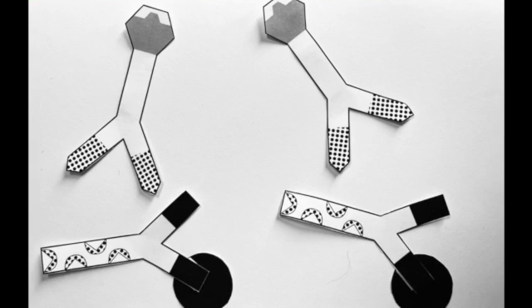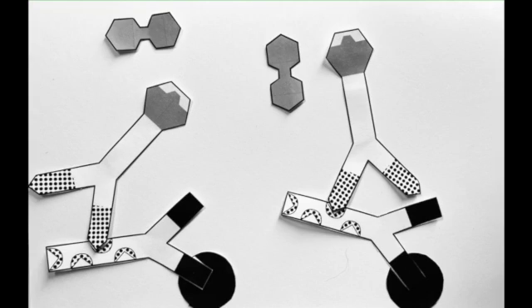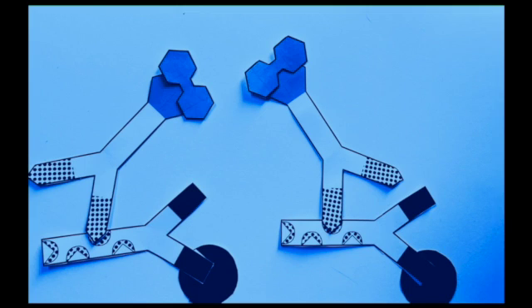An enzyme-linked secondary antibody is added next. In this step, the secondary antibody that has a bound enzyme now attaches to the constant region of the primary antibody. Finally, the substrate is added. If the sample turns blue, which indicates a positive result, the patient's sample contains antibodies to coronavirus.